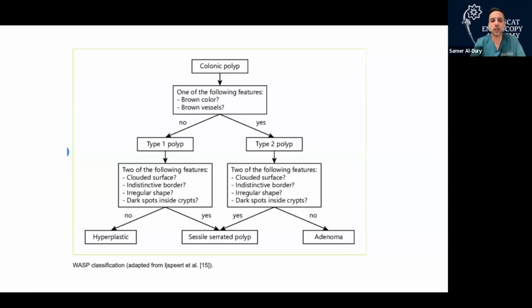And for people who are listening, before using acetic acid or any of that, if you want to see these lesions, do you think they're better seen or visualized in white light or in NBI or BLI? Actually, it depends on what kind of instrument I have in my hand.